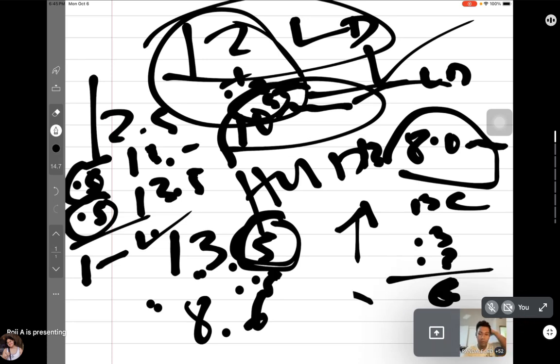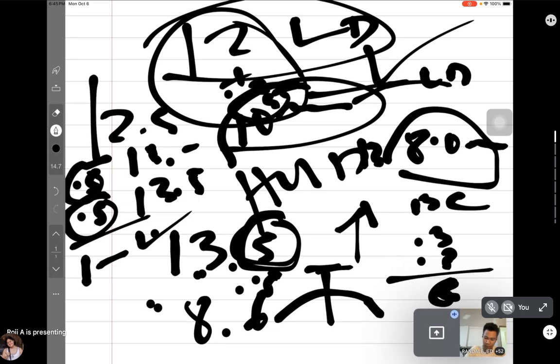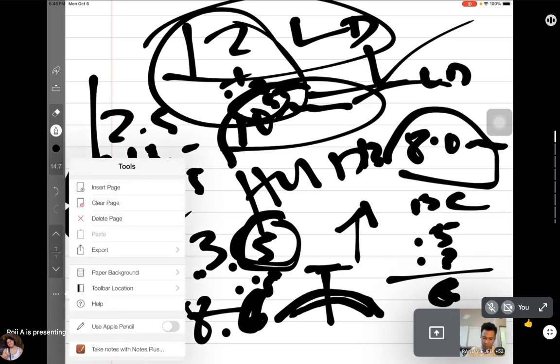Why? Because the larger the diameter, the tighter it will be. For me to loosen that, I need to change the base curve. That's why I added 0.3 for every 0.5. Because 8.6 is flatter than 8. The lower the value, the steeper it is when it comes to base curve. Correct? Do you follow?